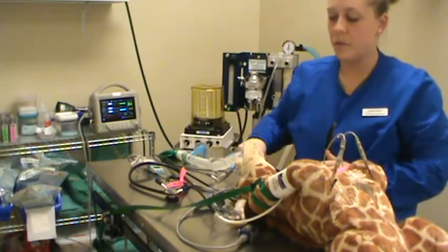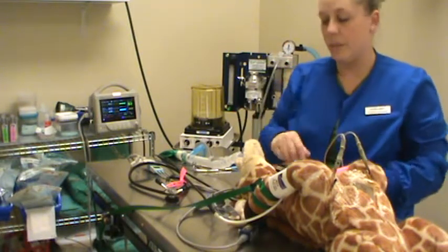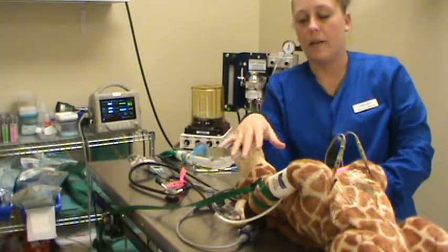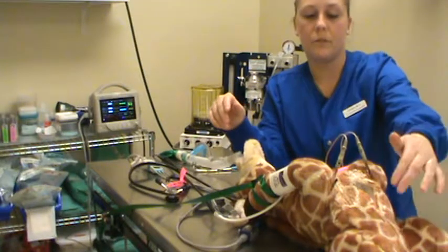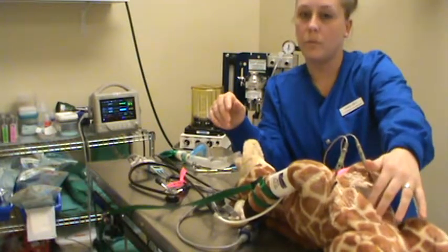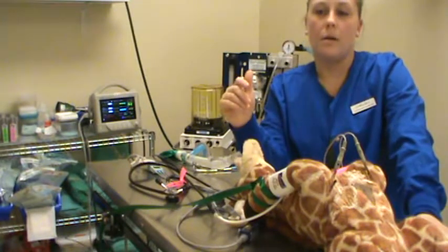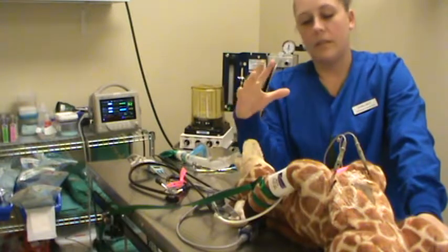So we're going to move to stage 3, plane 3, which is deep anesthetic. If this patient were going to have an orthopedic procedure on a limb, or if they were having deep visceral pain, where we're doing an exploratory of some sort, really getting in there and they're very painful, they need to be in stage 3, plane 3, which is a deep anesthetic.